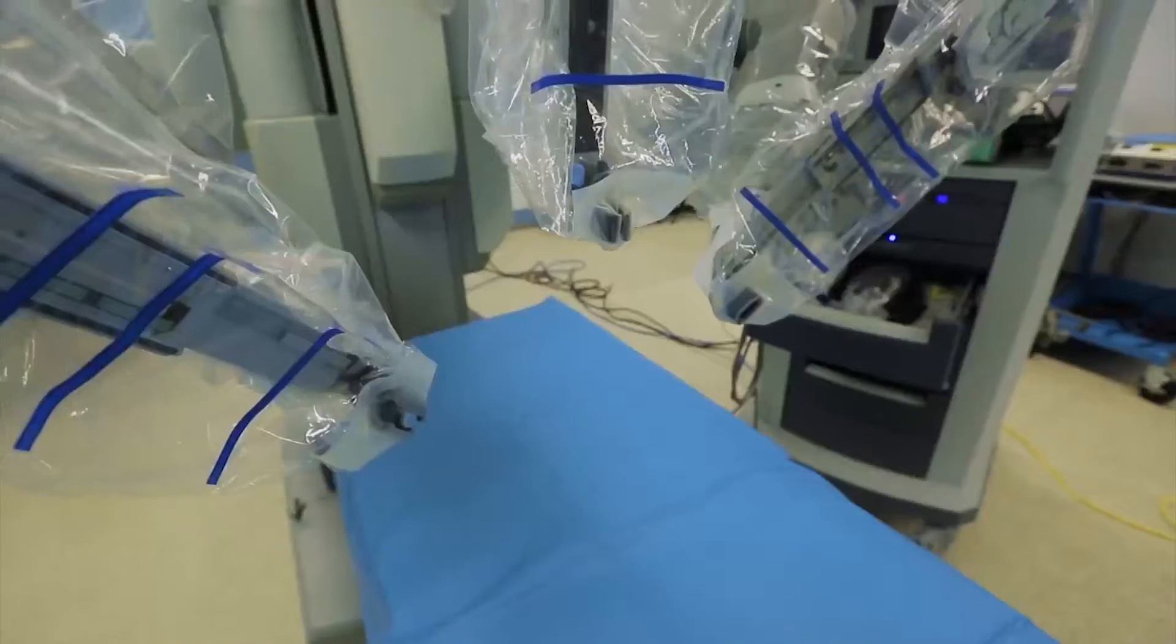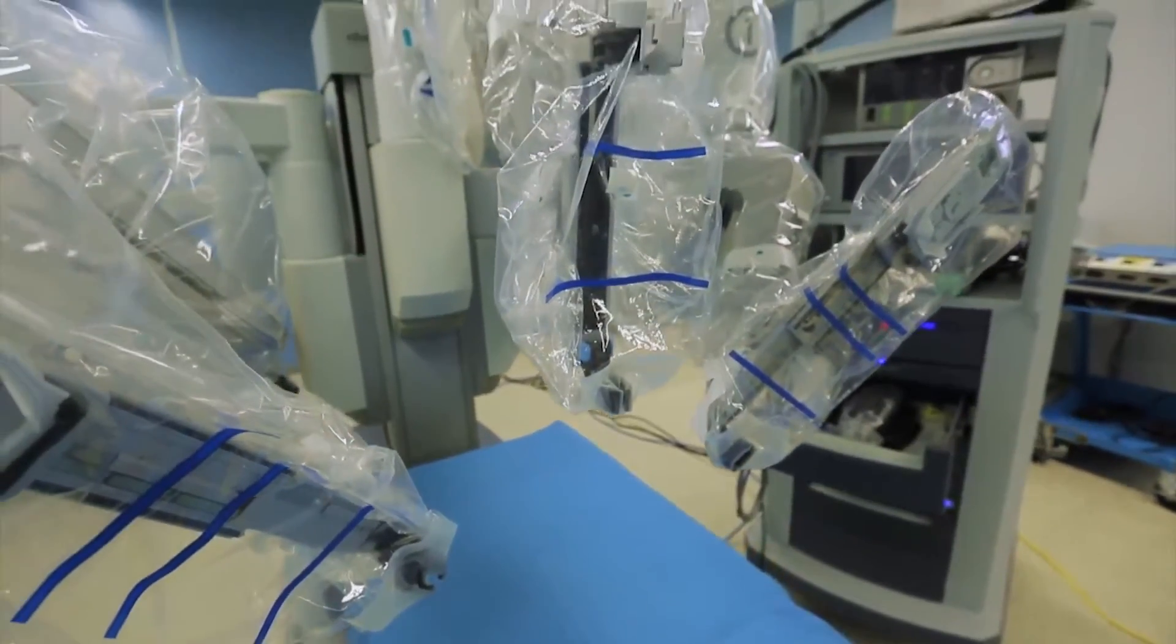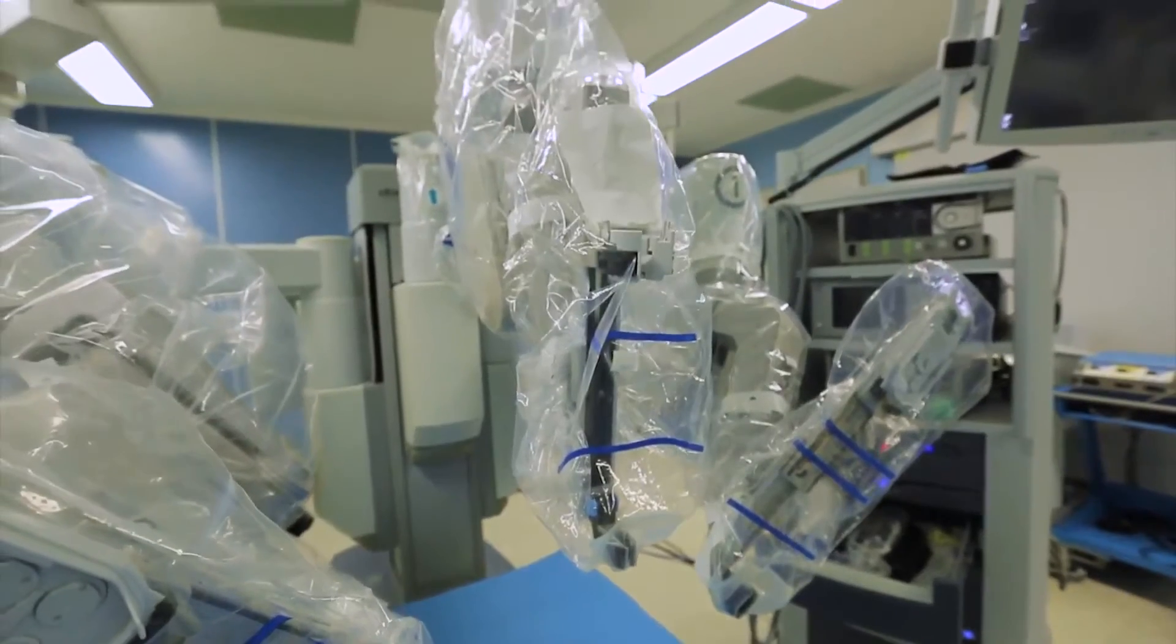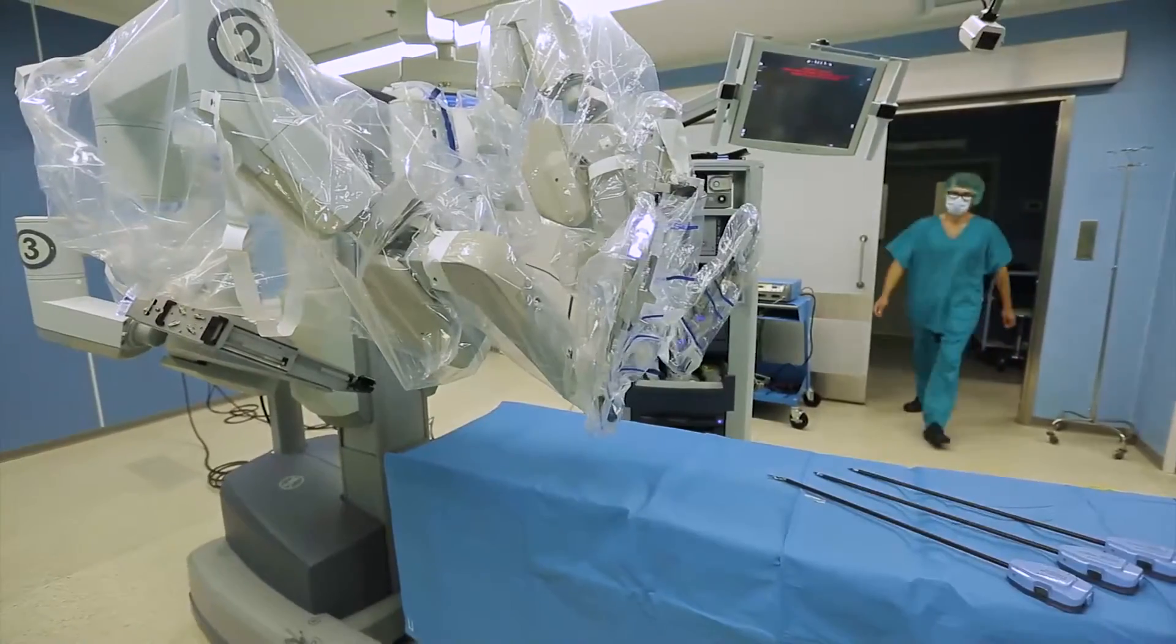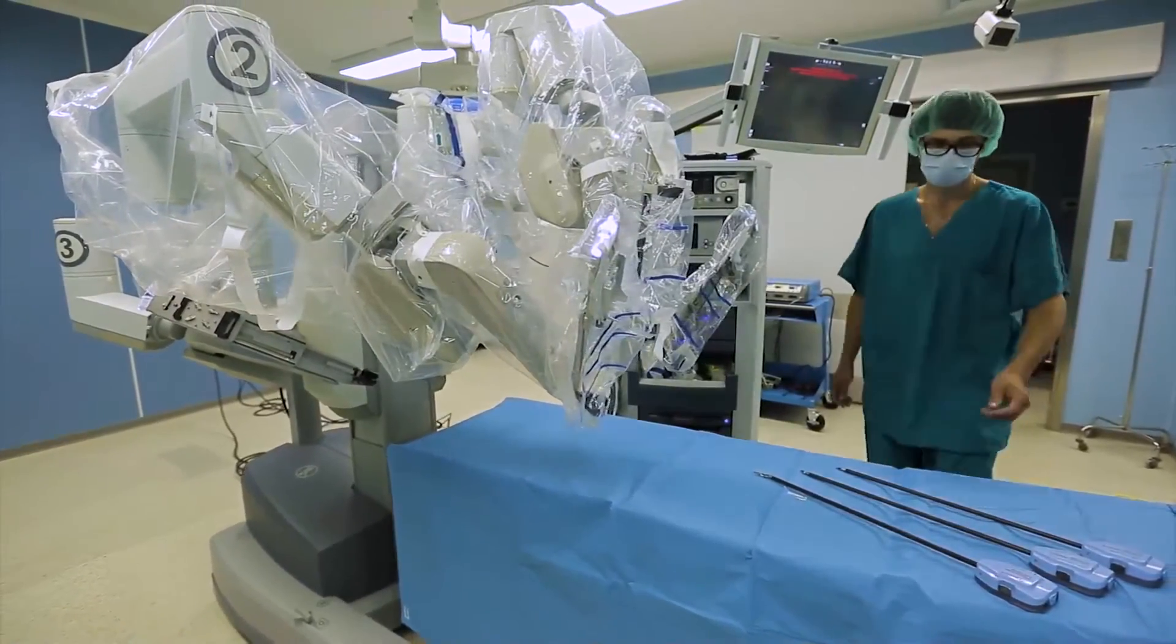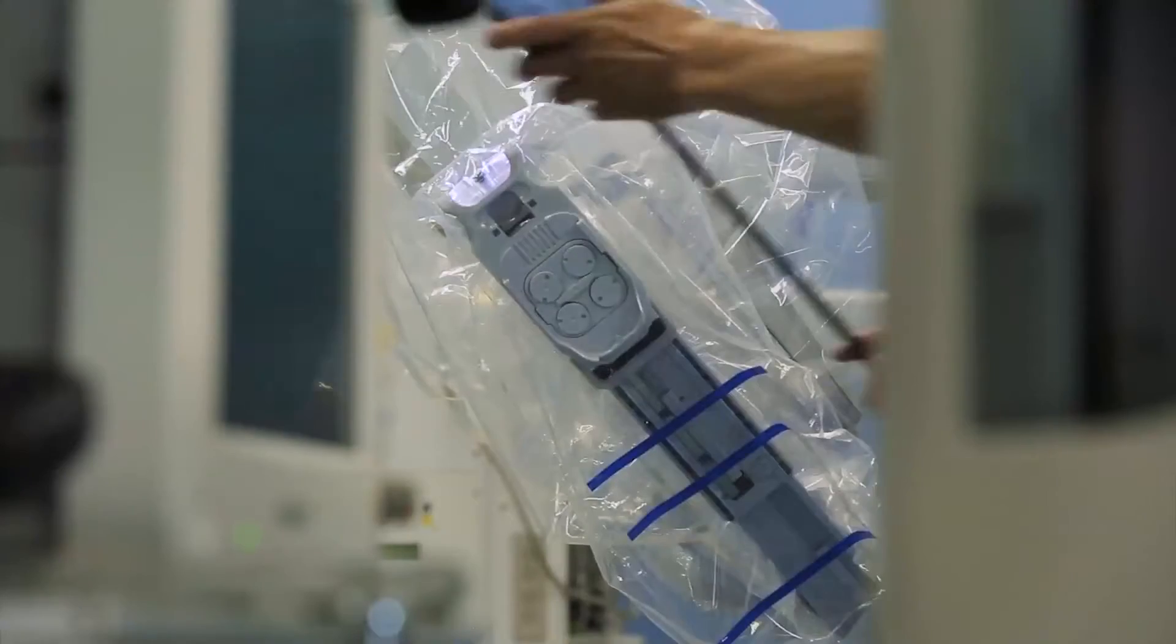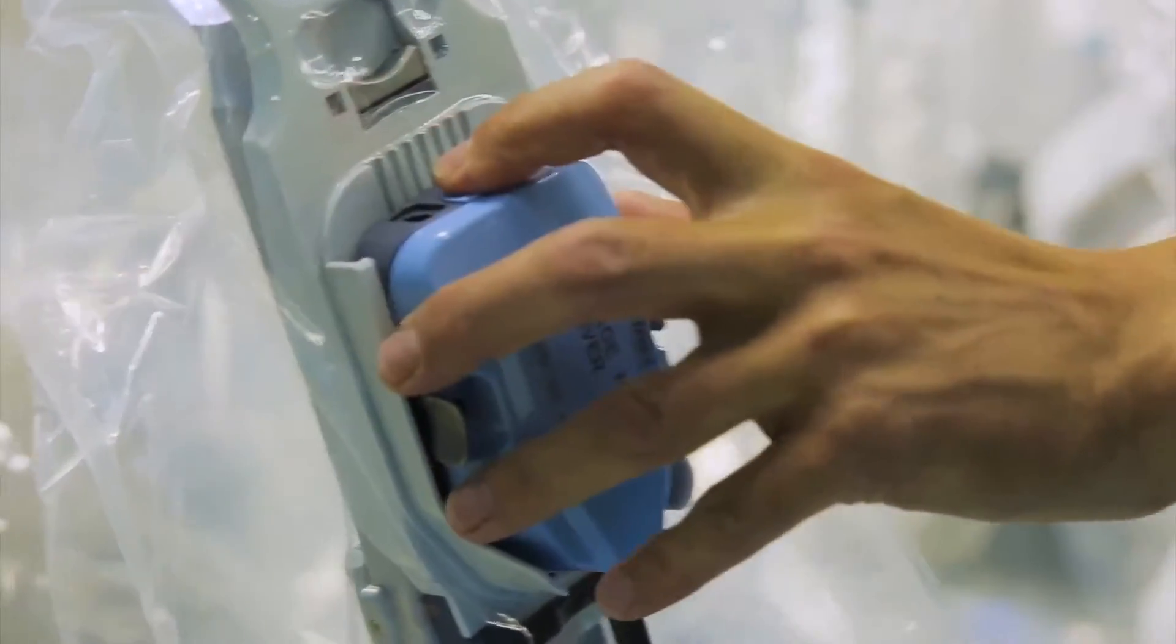It's called the Da Vinci, after the renowned Renaissance inventor. It is believed that Leonardo Da Vinci constructed the first anthropomorphic, that is similar to a human robot, which could move its arms and legs.